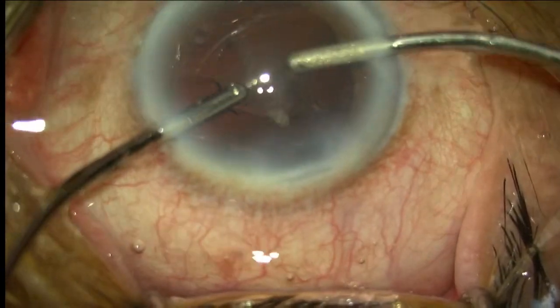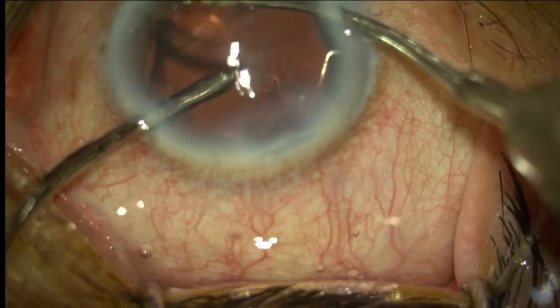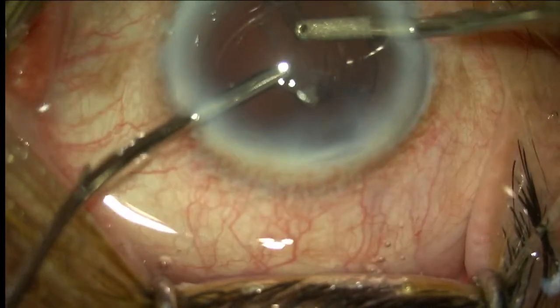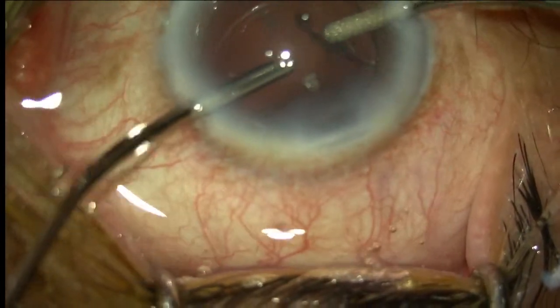Power I normally use 40 to 50, and for quadrant I have used 40, and for holding these hard nuclei you need a little more power. I was using 50, and my aspiration rate was 34 to 36. Vacuum was around 500.